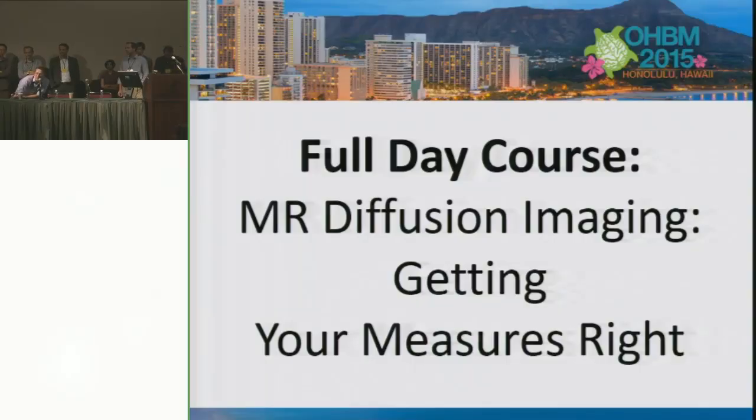So I think the meaning of FA is not just white matter integrity, because we just saw that it's not that. FA is telling us only how anisotropic the tensor is, how anisotropic the model of diffusion is. So it's about how you interpret the meaning of your result according to your study. This is my answer. Don't know if anyone wants to add something?